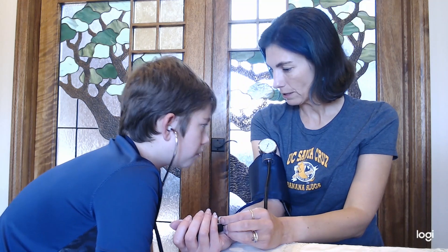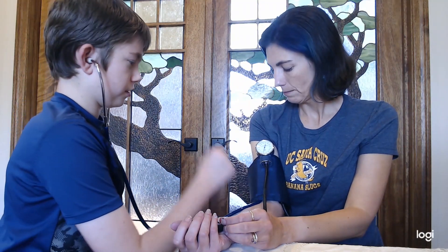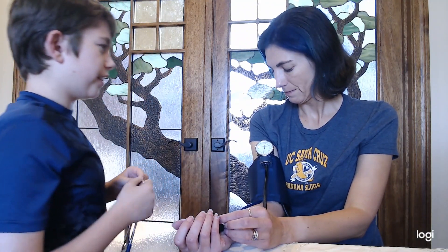What number did you start hearing the sound? 120. And when did you stop hearing the sound? In between the 40 and 20, like in that middle mark right there.